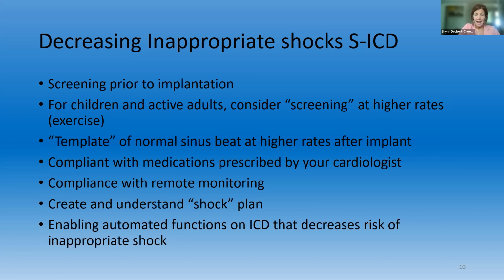Also, what we'll do is after the device is implanted, about a couple of weeks later, we'll take what the device sees as the QRS pattern at a higher heart rate with exercise. So we bring them back 2 weeks after their implant, get their heart rates up, and then take that as the device template so it knows the difference between a normal rhythm and an abnormal rhythm.